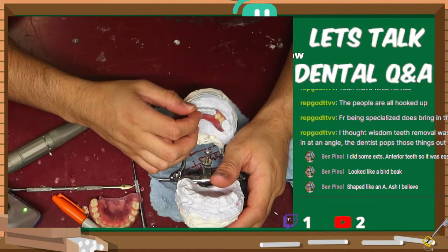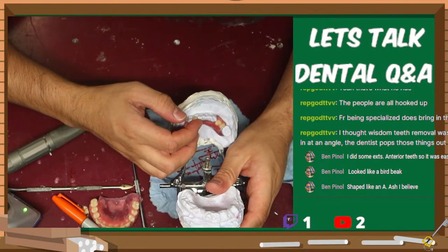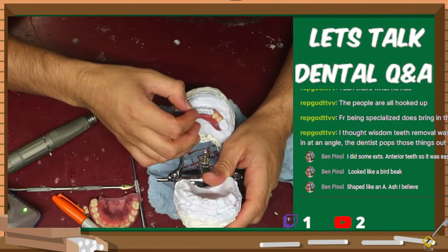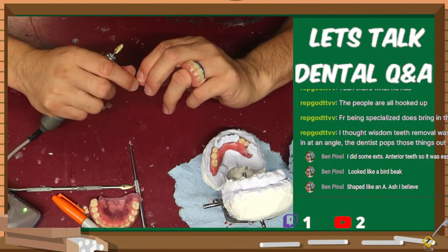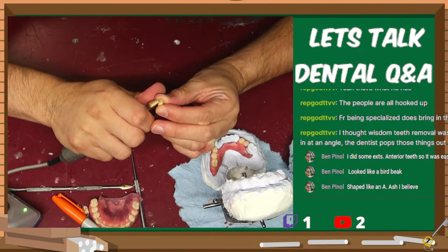Shaped like an A, Ash, I believe. I'm pretty sure that's what it was. No doubt about that. I need to take out this mesial aspect of this tooth a little bit more. If I can freaking hold it, I would be able to have a little bit of an easier time.